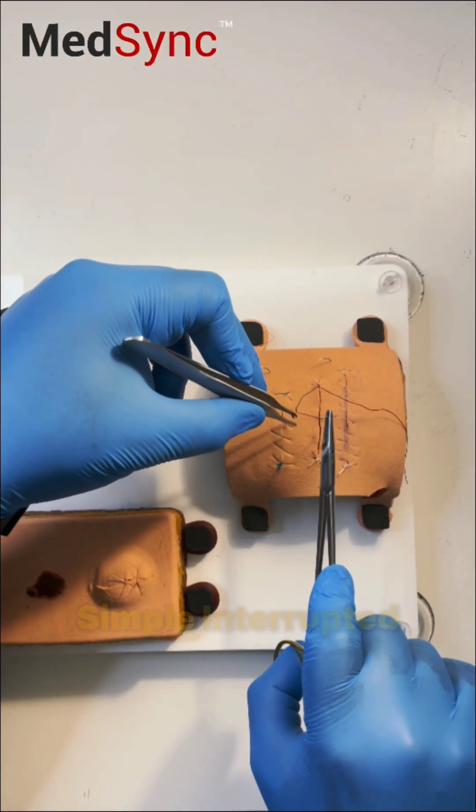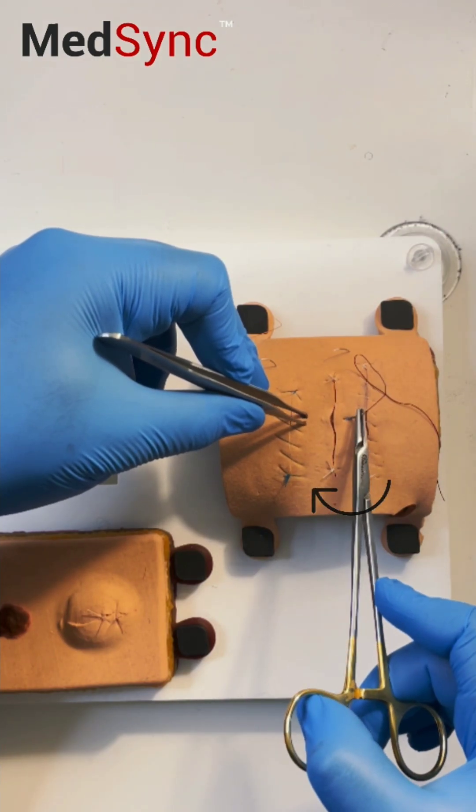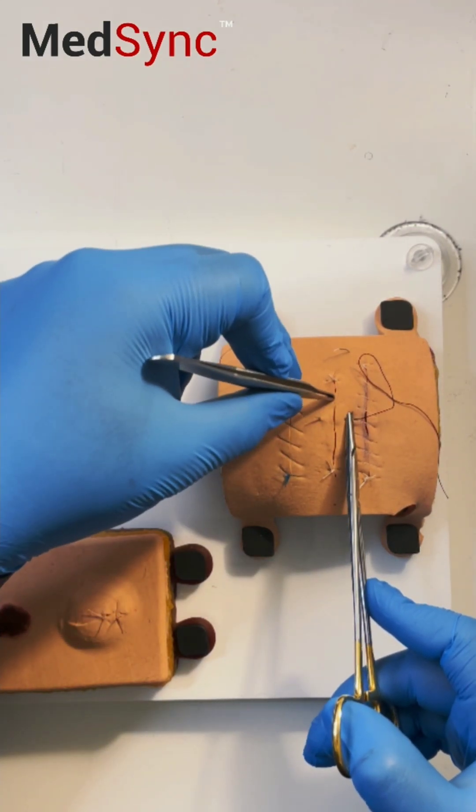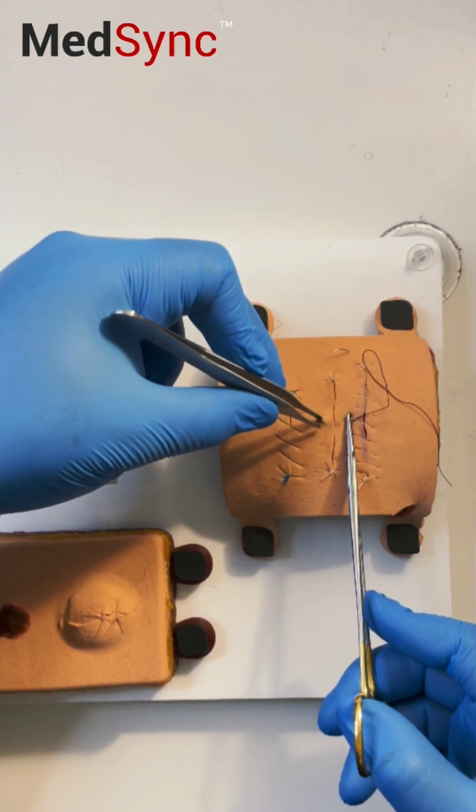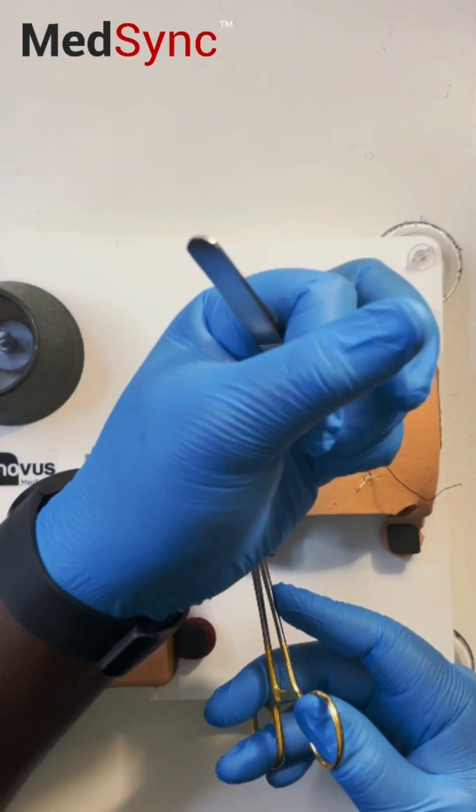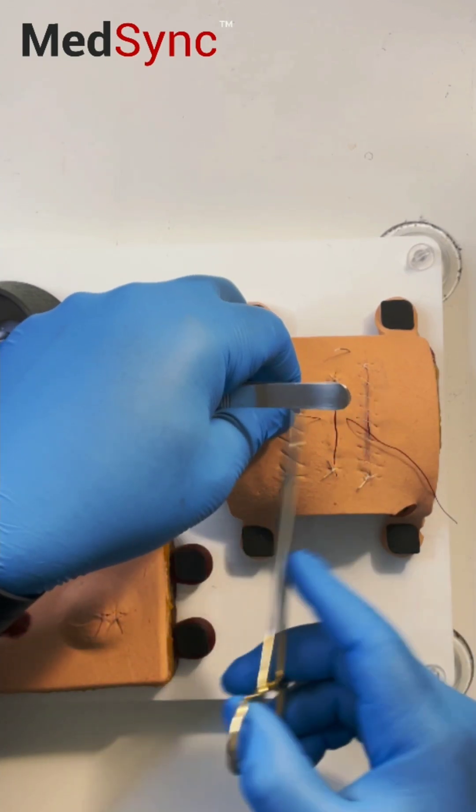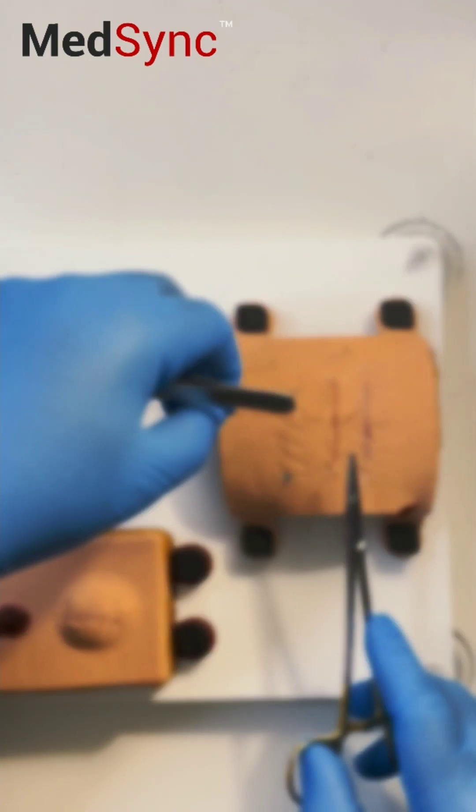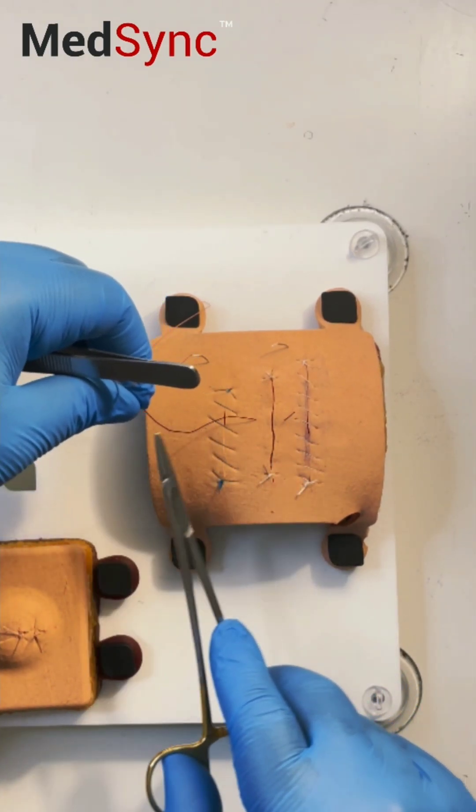The simple interrupted suture: enter at 90 degrees, rotate your wrist, come out opposite at equal distance from the wound. Here's the key to speed: pull the needle through, palm your forceps, grab the suture, and pull through with just one hand for economy of movement and real speed. Leave a short end and a long end.